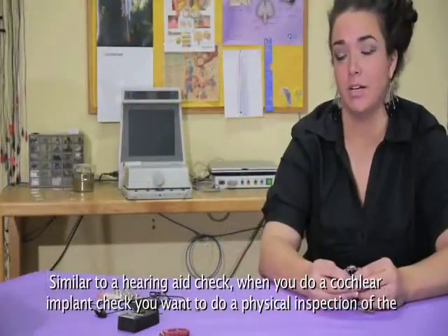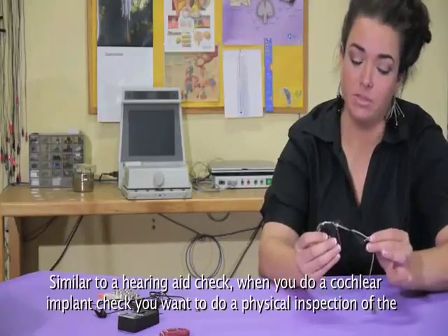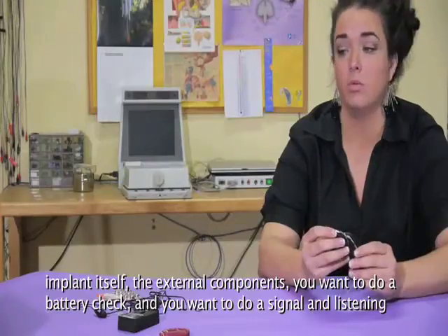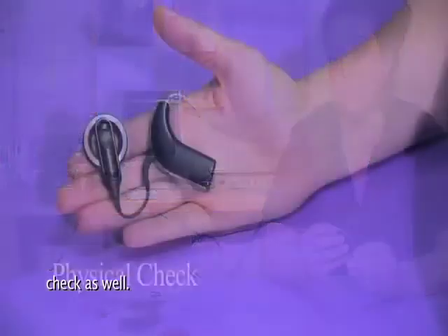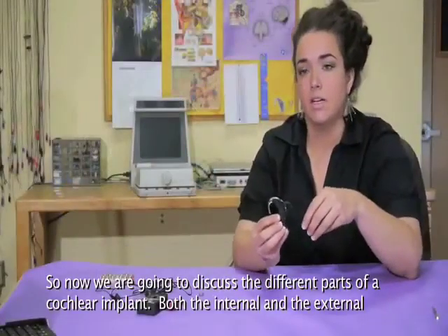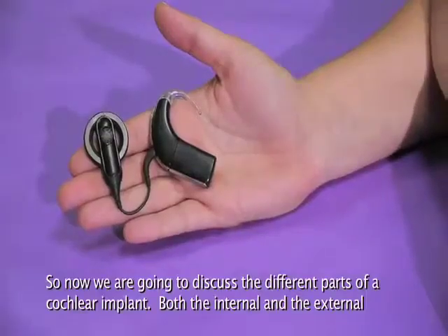Similar to a hearing aid check, when you do a cochlear implant check, you want to do a physical inspection of the implant itself and the external components. You want to do a battery check, and you want to do a signal and listening check as well. We're going to discuss the different parts of the cochlear implant, both the internal and external components.